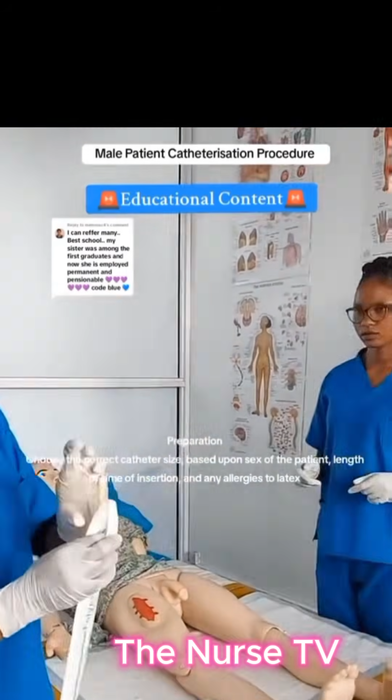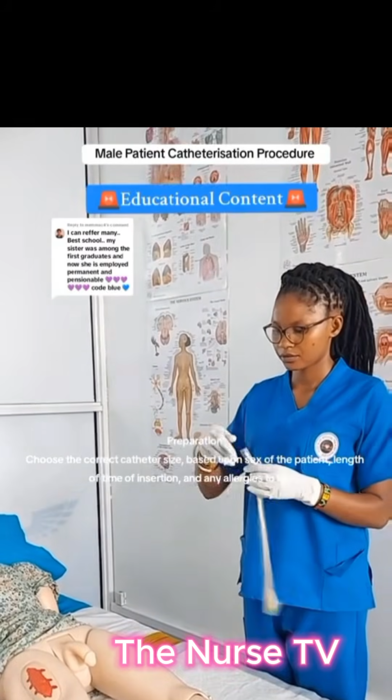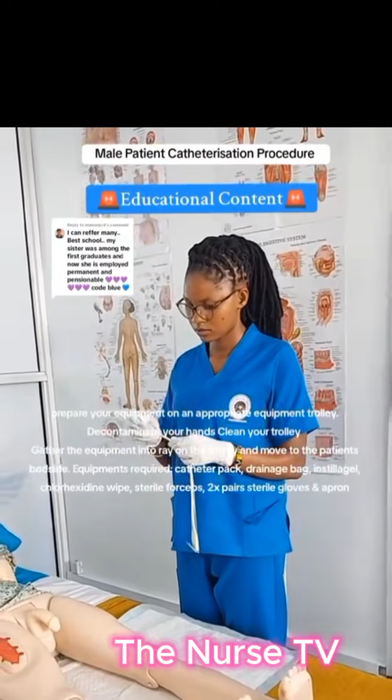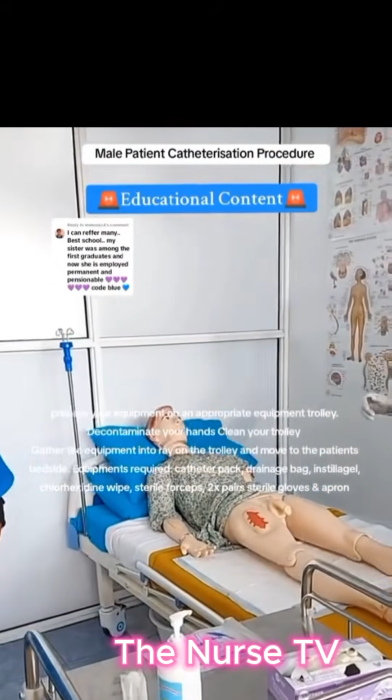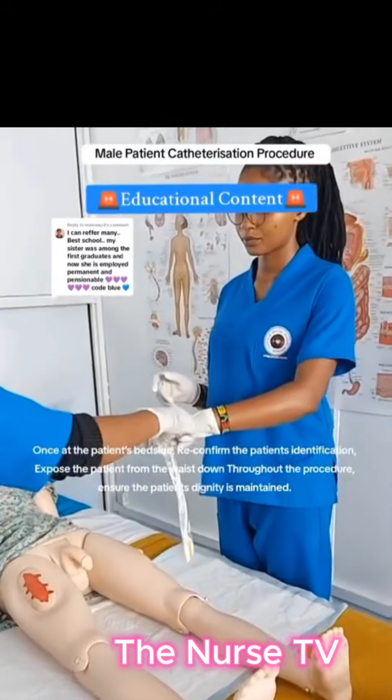Preparation. Choose the correct catheter size based upon sex of the patient, length of time of insertion, and any allergies to latex. Once at the patient's bedside, reconfirm the patient's identification.